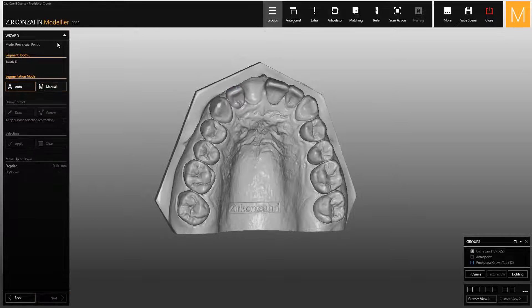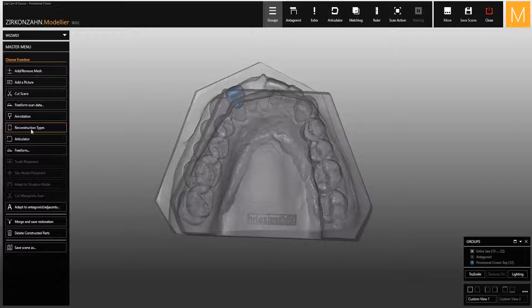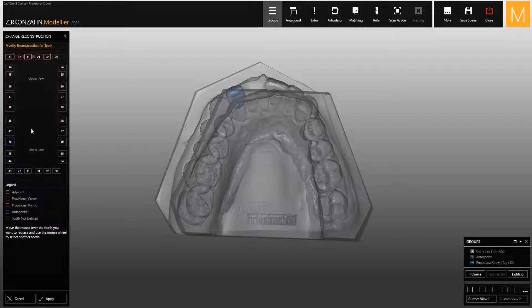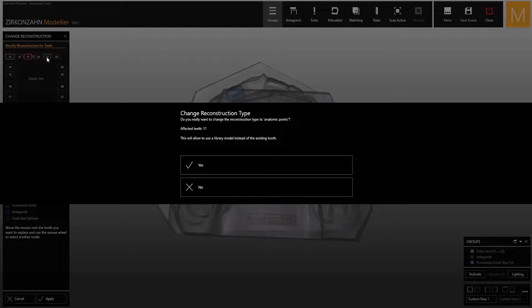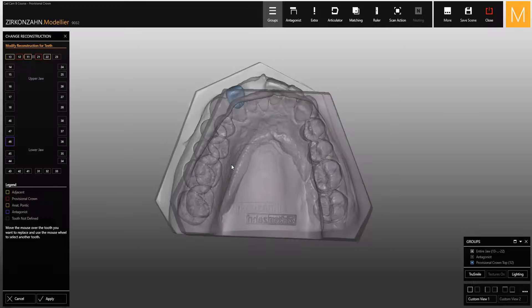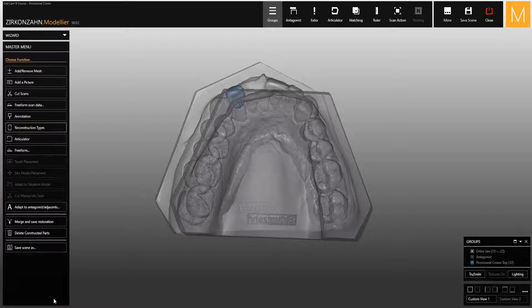Click on the master menu and select the reconstruction type window. Now select the tooth, then confirm that you want to change the reconstruction type from eggshell pontic to anatomic pontic.